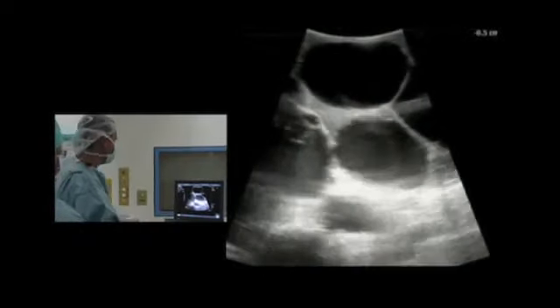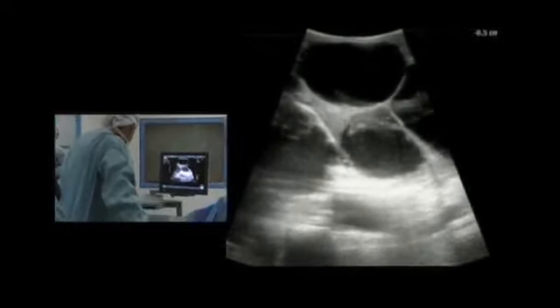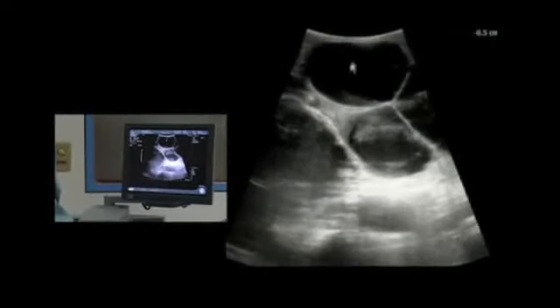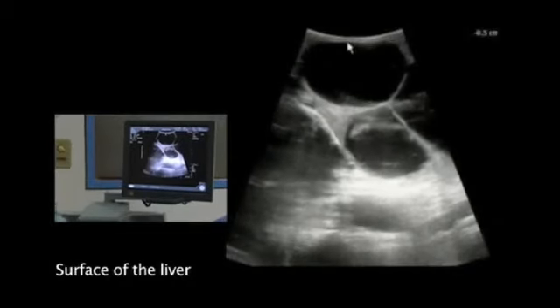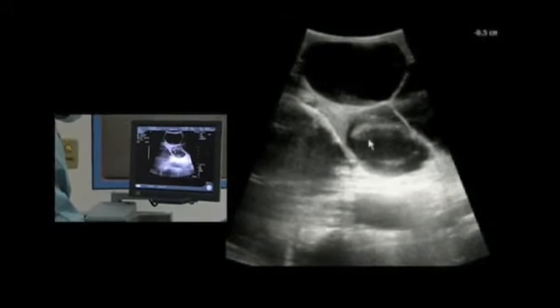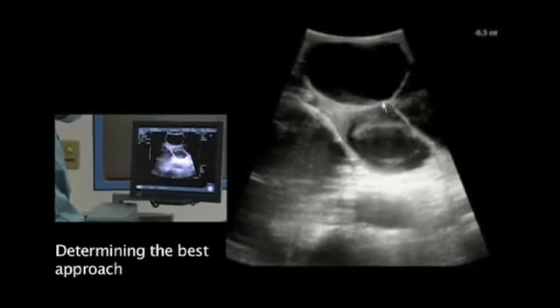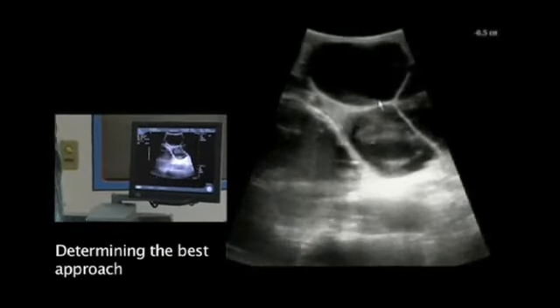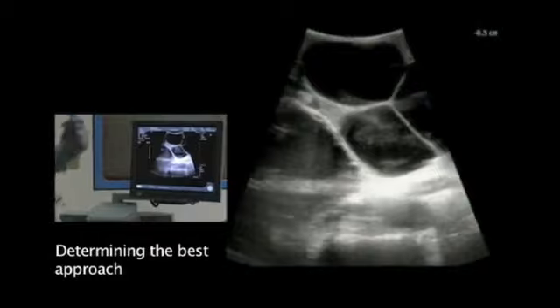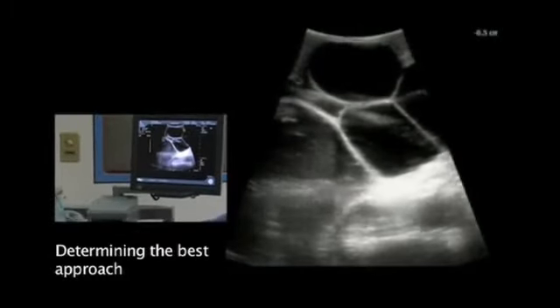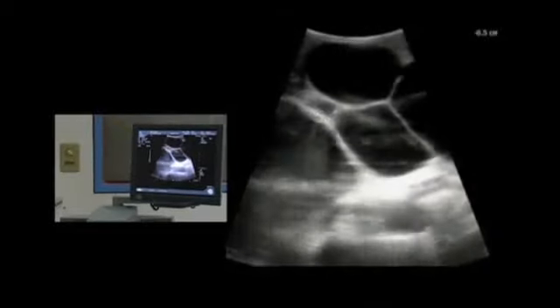You can see the cyst in the anterior part of the image now. Let us put an arrow on. Here we have the surface of the liver, and here we have a very thin layer into a cyst. From that cyst there is only a very small septum and another small septum to the borderline of the dominant cyst. So if we could break down this area here, then we will be directly accessing the three largest cysts in the left liver lobe and the large one in the right. That will definitely give us good access.